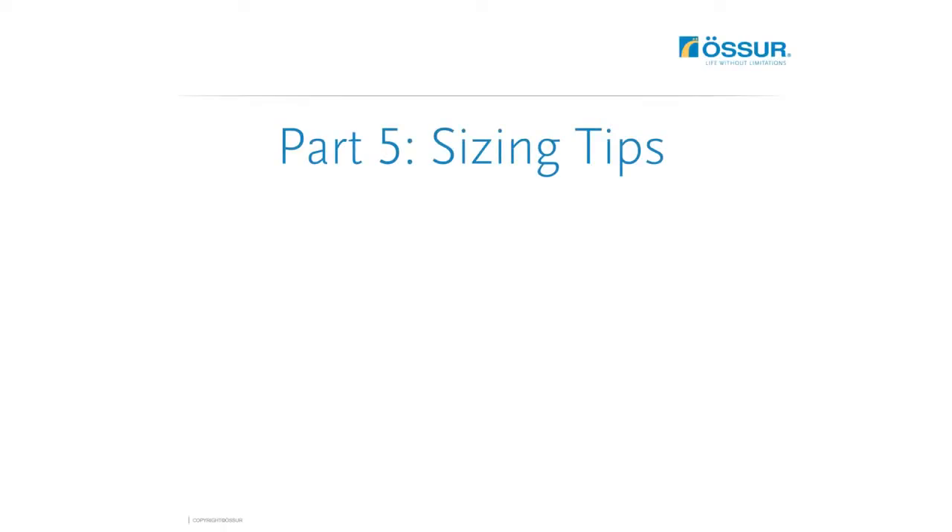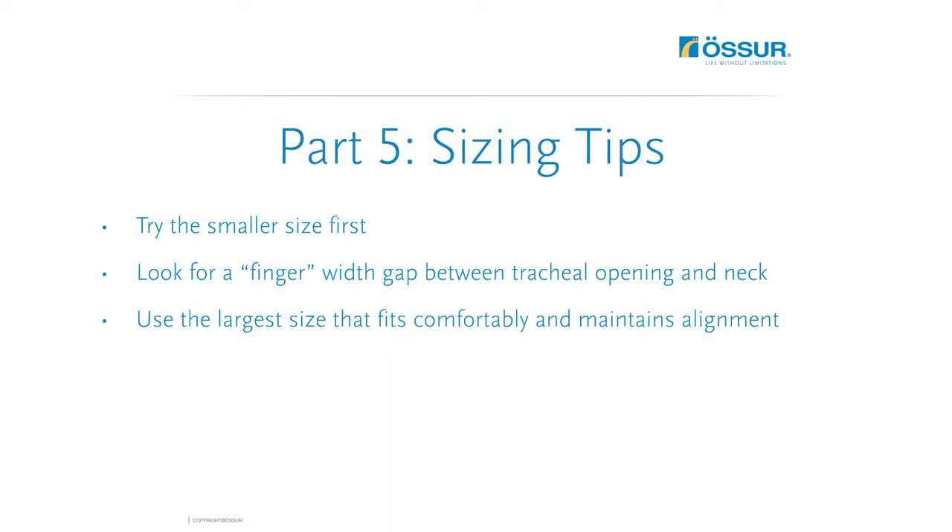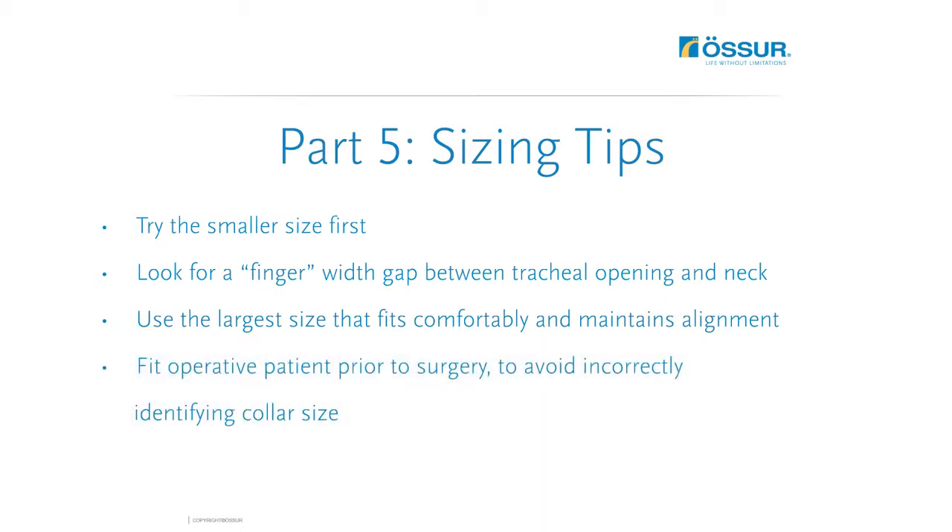If you are deciding between two consecutive sizes, try the smaller size first. There should be a finger gap between the tracheal opening and the neck. If the collar fits too closely or tightly to the neck, size up to the next collar size. Use the largest size that fits comfortably and maintains the desired treatment position. To ensure proper sizing, it is a good idea to fit operative patients prior to surgery, as collar size may be incorrectly identified in the presence of post-operative dressings and swelling.